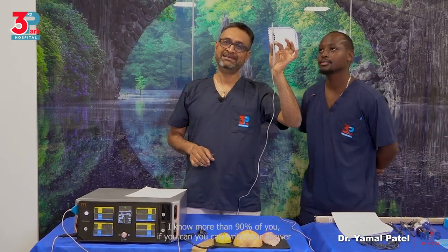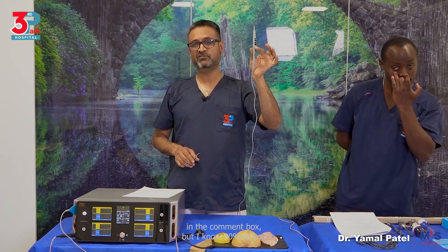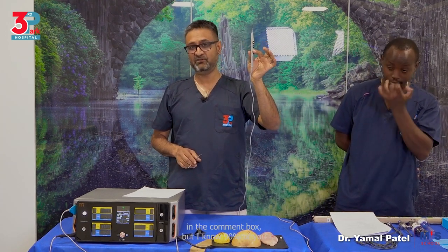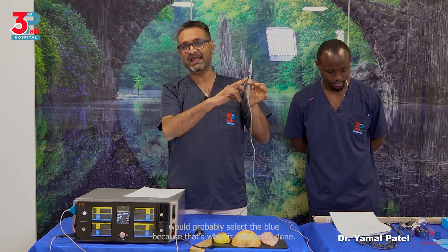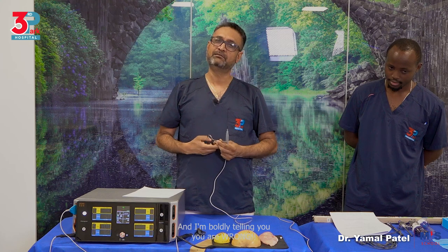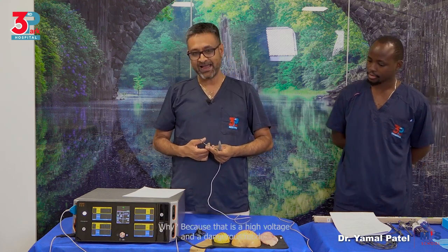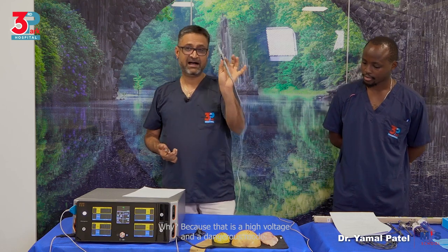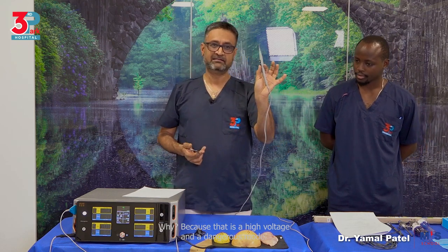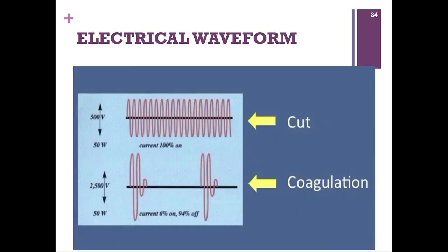I know more than 90% of you, if you can write your answer in the comment box, but I know 90% of you would probably select the blue because that's what is commonly done. And I'm boldly telling you, you are wrong. Why? Because that is a high voltage and a dangerous mode. If you remember what I said, it's like a lightning strike, on and off.